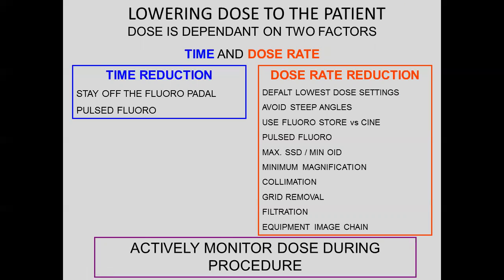How does magnification affect this? Okay, as you increase your magnification, you're irradiating a smaller patch of skin. So you have the same amount of radiation. Actually, usually when you mag up, the machine actually gives a little more radiation. So you're concentrating the same amount or a little bit more radiation to a smaller area. So you're increasing the dose rate to that small area. Does that make sense? Yeah, so that's where you can actually get almost a square increase in your dose rate to the local tissue as you mag.